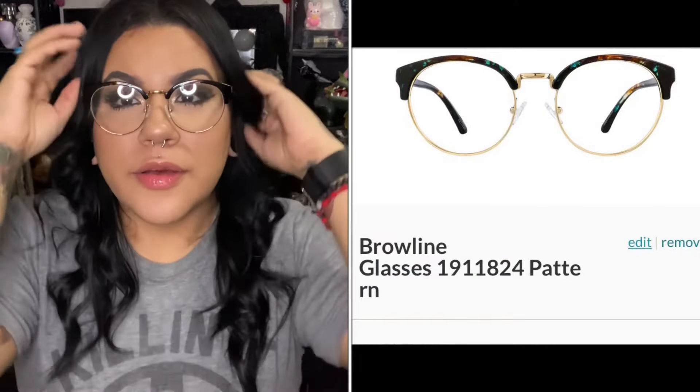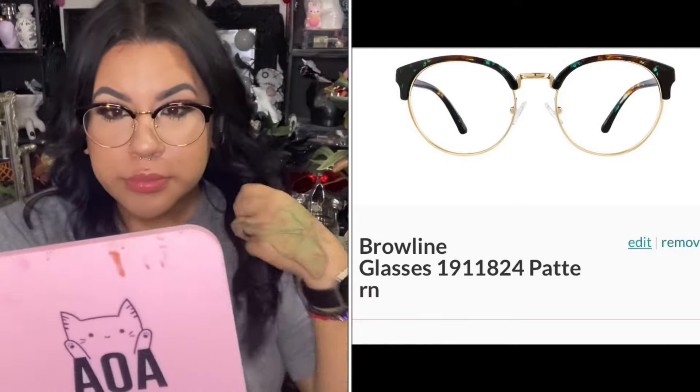These are one of the pairs. I decided to do something different — I like these frames. I'm probably just going to get the lens removed and get the prescription put in. The lenses are a lot bigger compared to my other ones. That's one style, and then I got a different style that looks just like what my sister has.